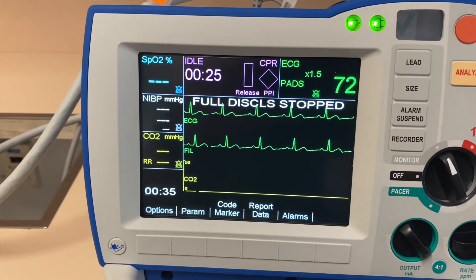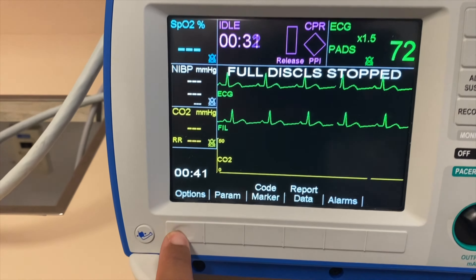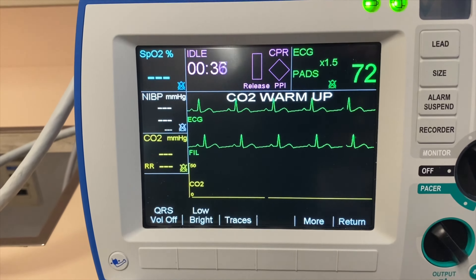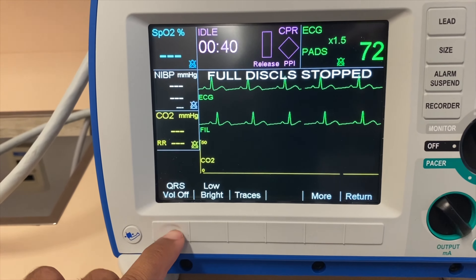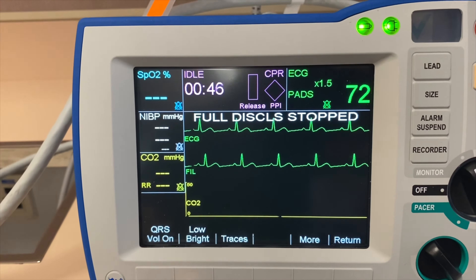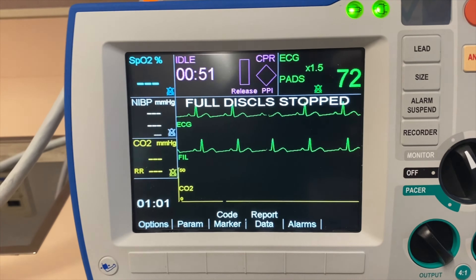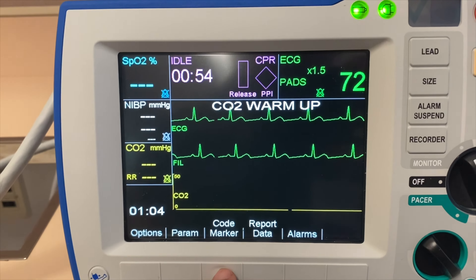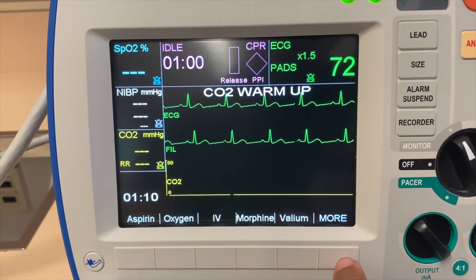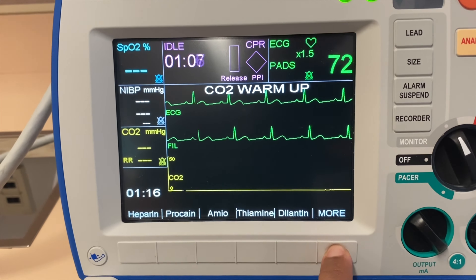Note there are two ECG rhythms in there. When you click Options, it will give you some options to change settings. If you want the beeping to stop, click QRS Volume Off. You can also adjust to low or high brightness. For code markers, when you are monitoring a patient, it will give you different options — different medications and treatments appropriate for patients being monitored using the Zoll defibrillator.